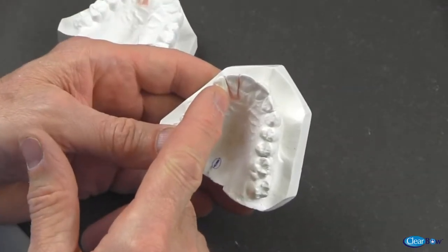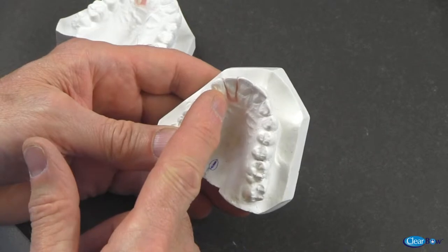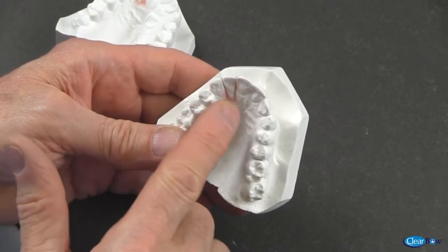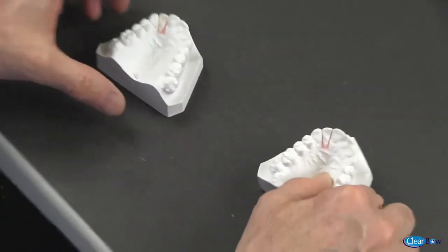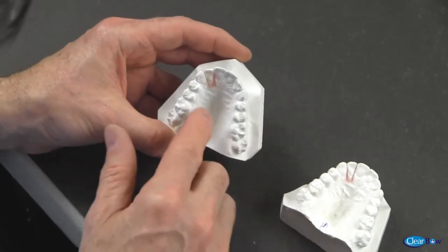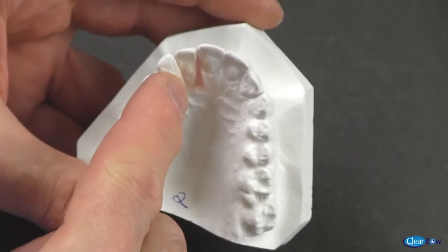On model number one, the upper right lateral tooth has been cut and waxed back into its original position. On model number two, the same lateral tooth has been cut and rotated mesial lingually.